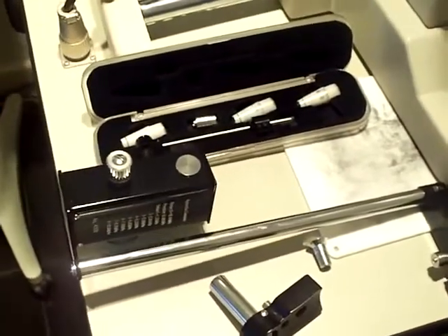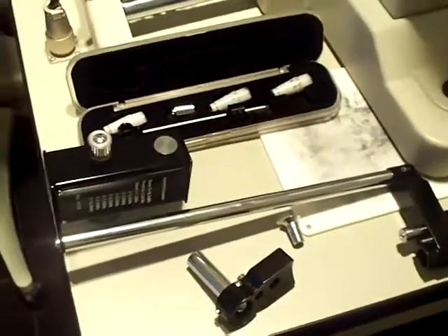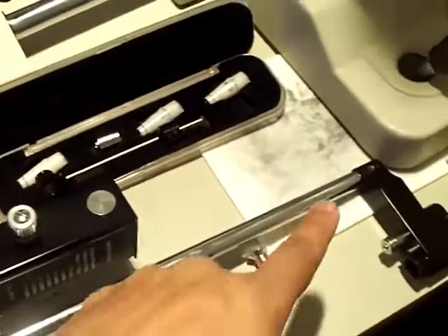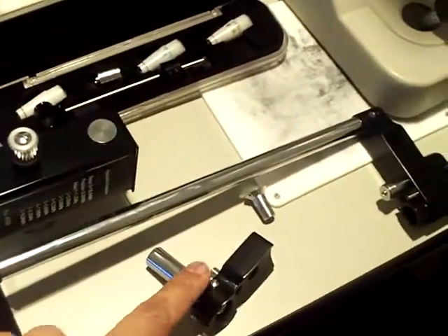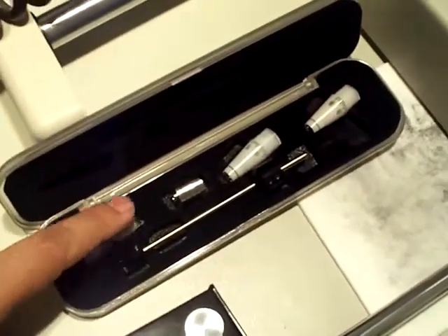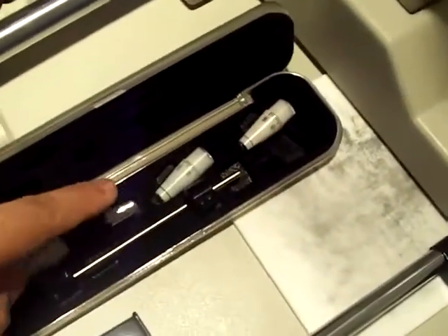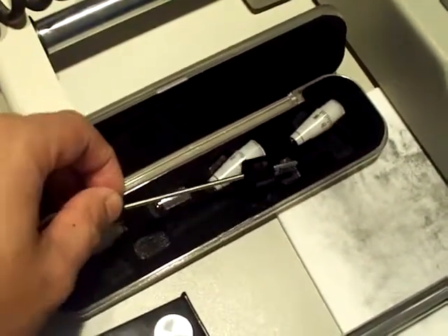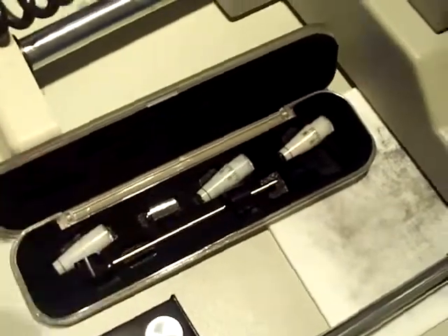For those of you who have purchased the R-Type Goldman Tonometer and need help installing: in your package you will get the R-Type Goldman Tonometer, the R-Type mount, and a large screw. In your accessory box you will get three prisms, a calibration weight, and the arm for Goldman to hold the prism in place.